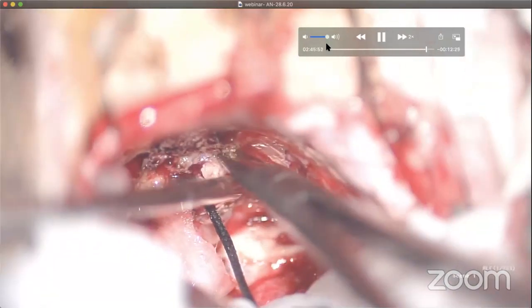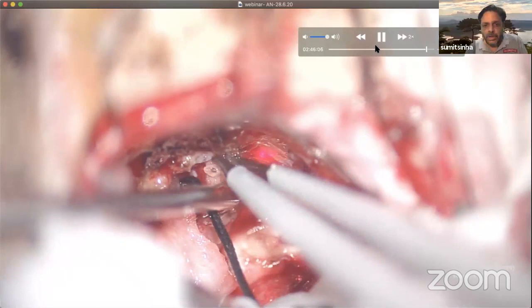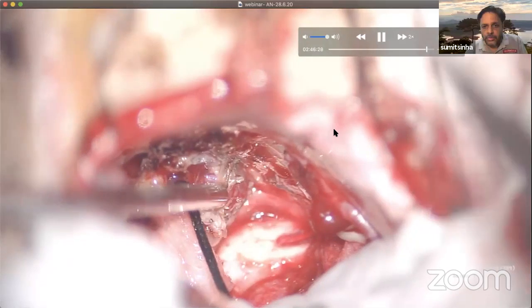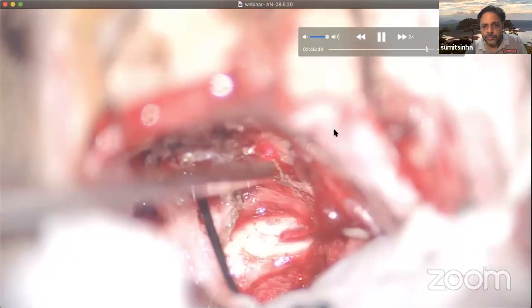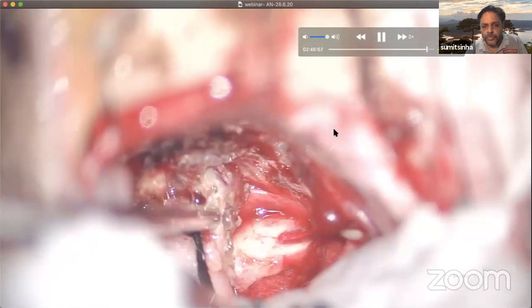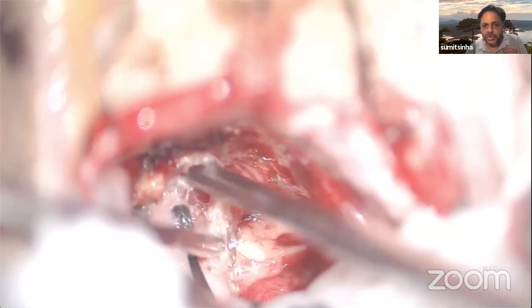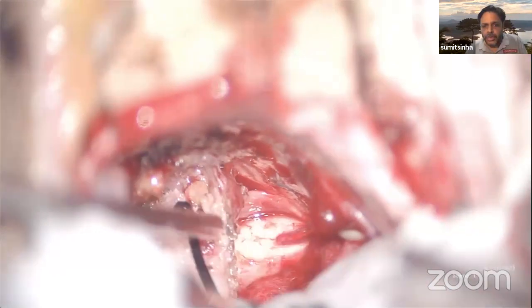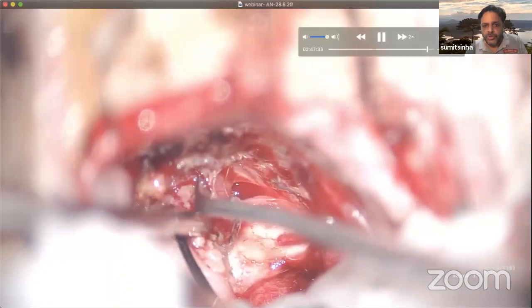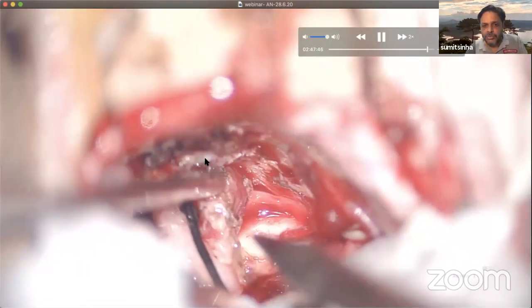So this is the removal of a small portion of the tumor, which is attached to the lip of the porus acousticus. Very low setting of the CUSA, only removing the tumor inside the arachnoid. And then you leave go of the CUSA, don't use it again now. And then remove this capsule here, which is attached to the lip of the porus.